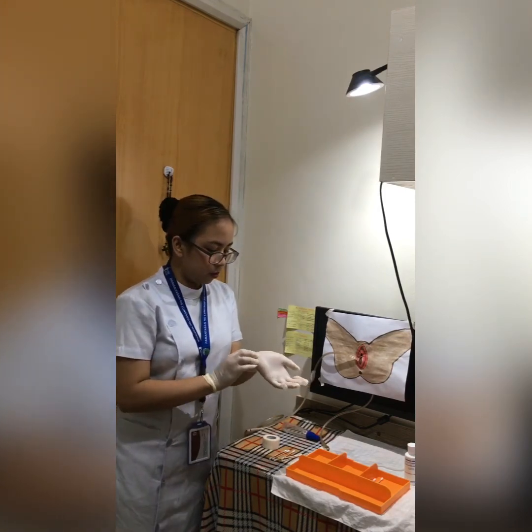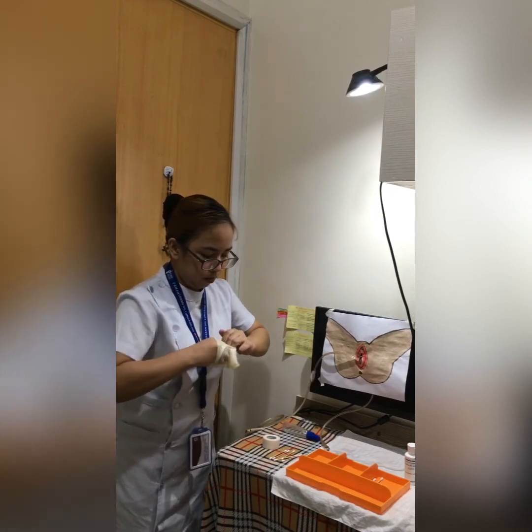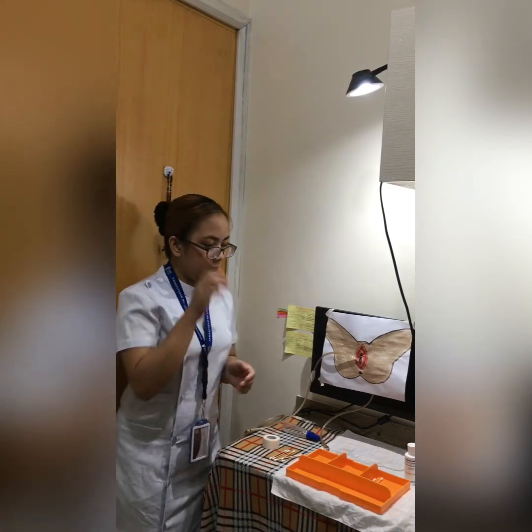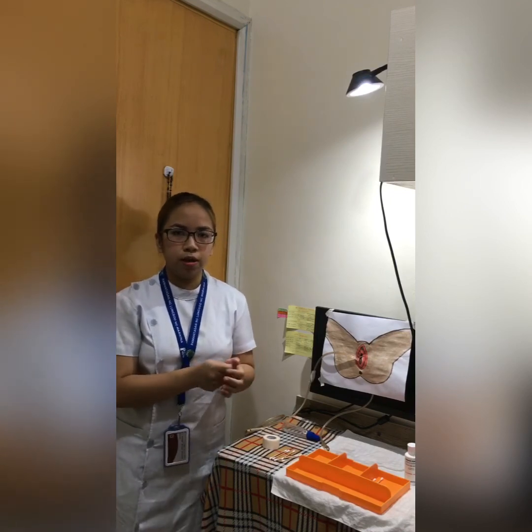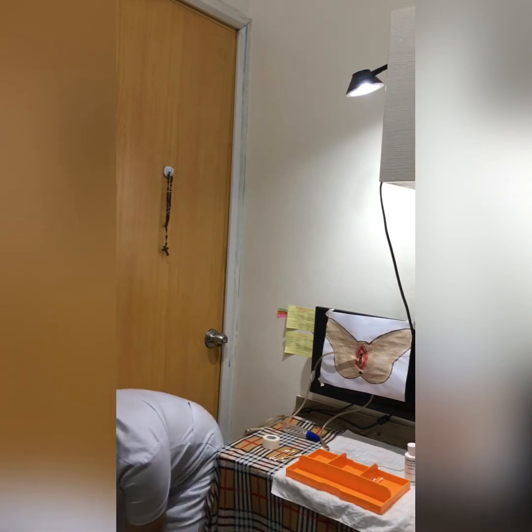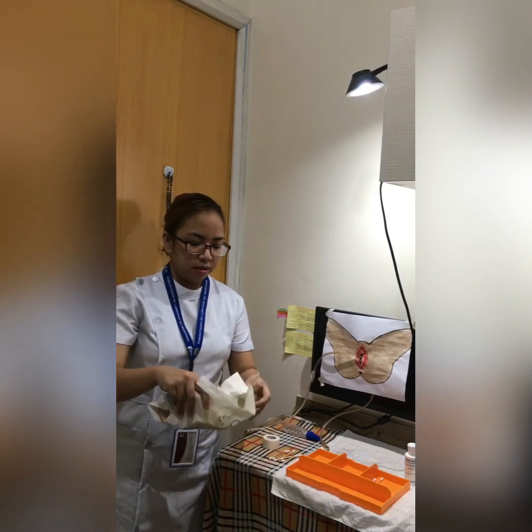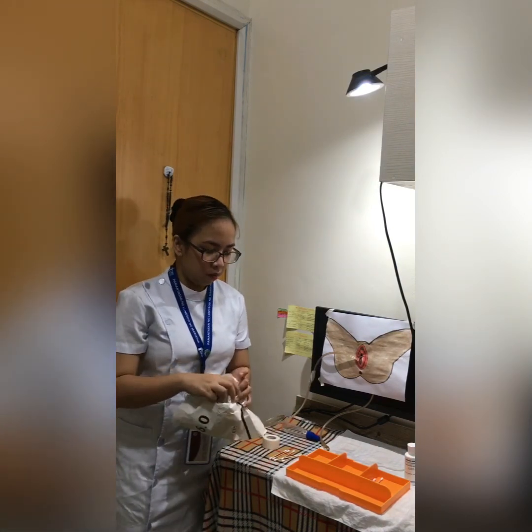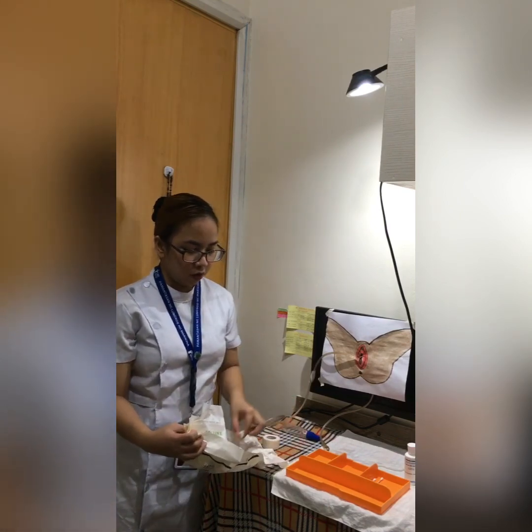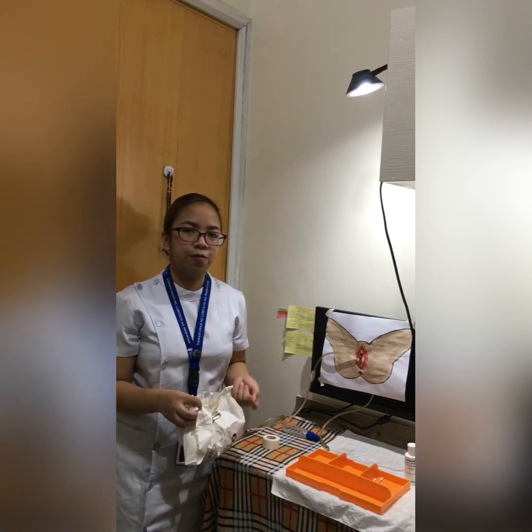After that I'm going to remove my gloves and dispose of them. And then I'm going to dispose of all the materials that I used. Then I'm going to perform hand washing. Then next I'm going to document the findings, and any unusual findings must be reported to the physician. Thank you.